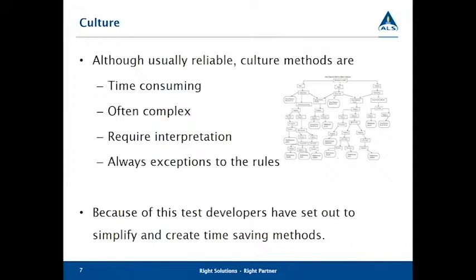Is it a dark blue colony or is it a light blue colony? Is it producing gas or is it not producing gas? Even though there are predetermined outcomes to these questions or tests, there's always exceptions to the rule. Every culture method will tell you what the typical colony should look like, but if you don't see typical colonies, then they say you should also continue on with what they call non-typical colonies.